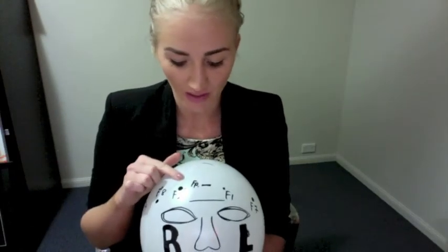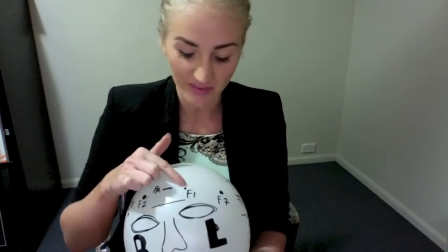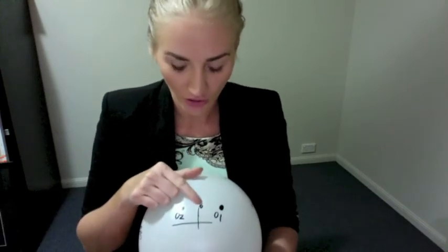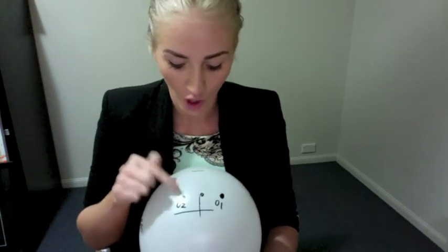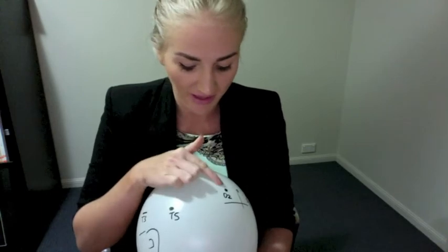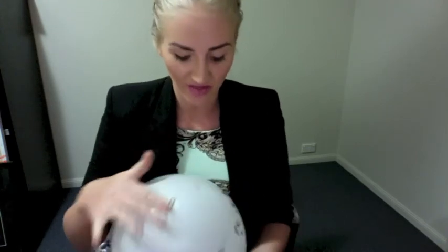Now take 20% from FP2 to give F8 and 20% from FP1 to give F7, and repeat on the back. So we have point O, 10% either side is O2 and O1. 20% from these points gives T5 and T6, and that gives you your horizontal plane.